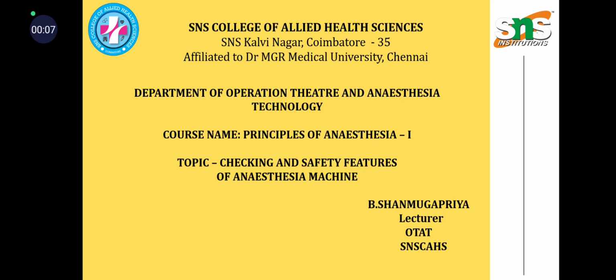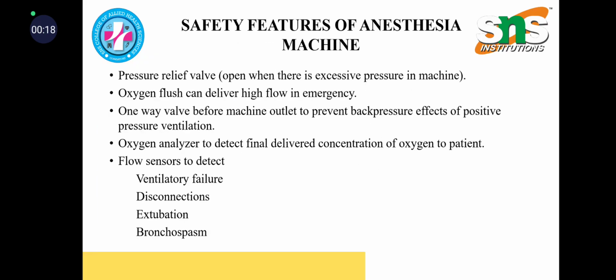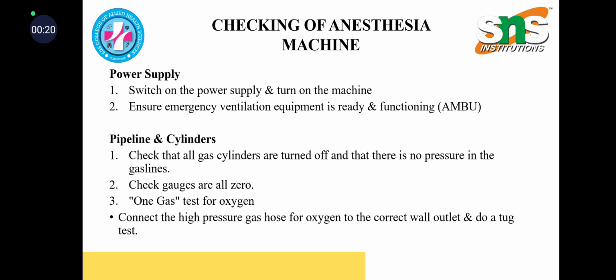In the last section, we have seen a topic under Principles of Anesthesia 1, that is Safety Features of Anesthesia Machine. In this section, we will be continuing with checking of anesthesia machine.